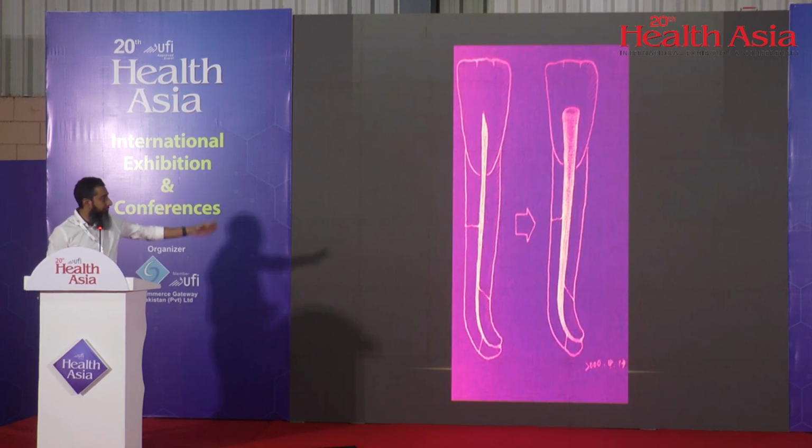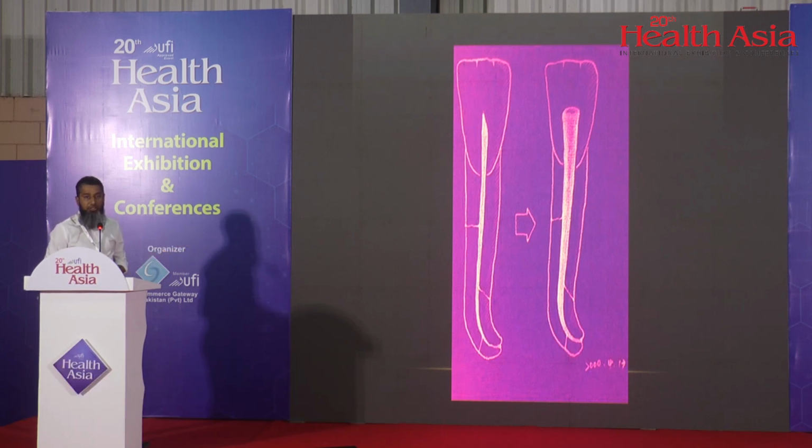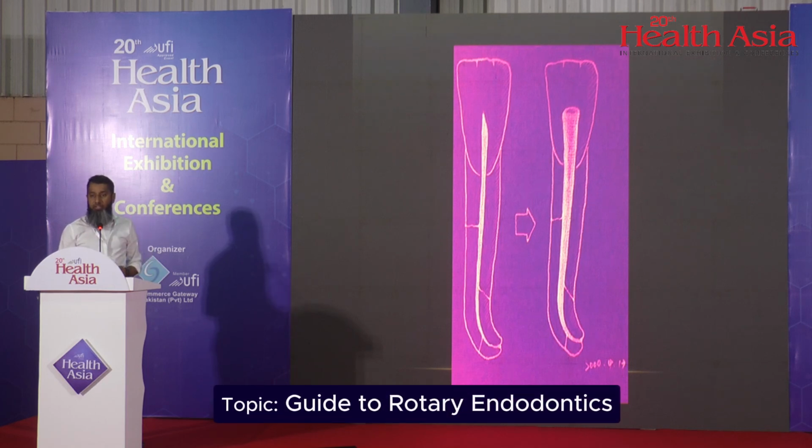So here you can see the initial shape of the canal. With rotary, our objective should be that the shape of the canal should be maintained. And you can see with manual, there are high chances that this apical curvature may not be negotiated that well, and ultimately you will result in apical transportation. That leads to some part, the apical part of the canal, either being uncleaned or unfilled, and that can later on cause problems. So with rotary, it's easier to follow the shape of the canal, which is our objective, that when we're doing rotary, the initial shape of the canal should always be followed.